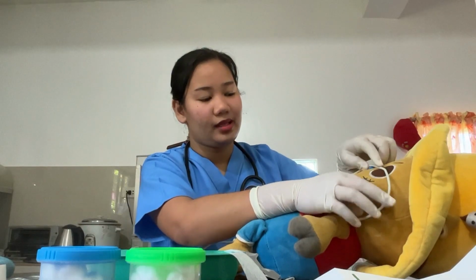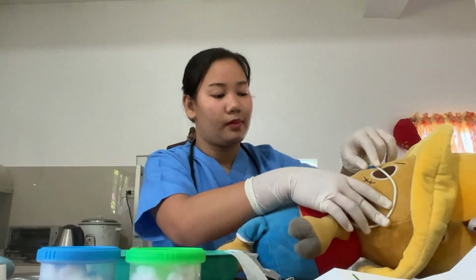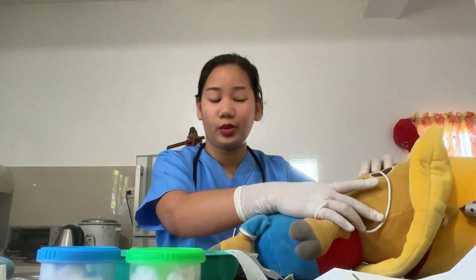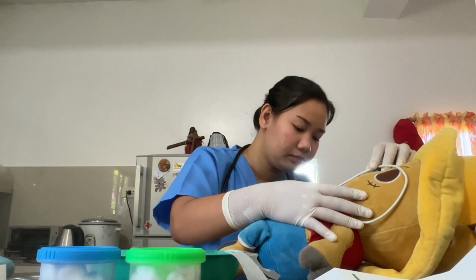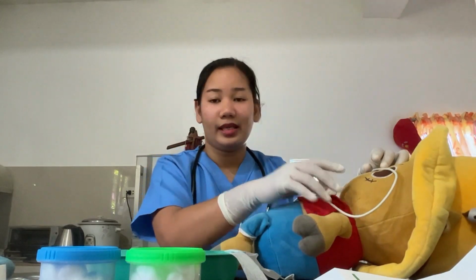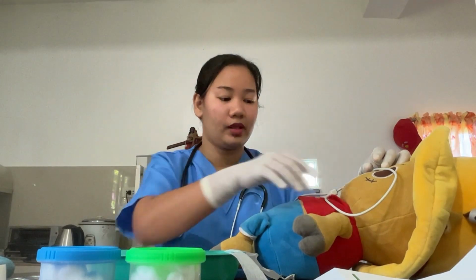I am advancing this tube as far as the insertion point. Okay. Now, I'm going to check the back of her throat. So, ma'am, please say "Ah." Ah. Okay, so it is clear and the tube is not curled at the back of her throat.